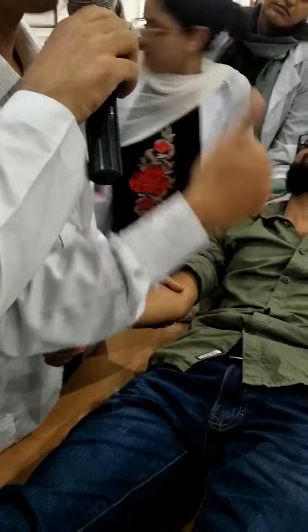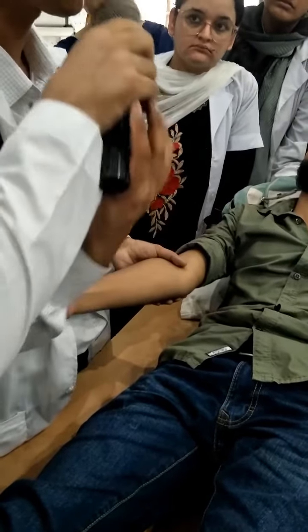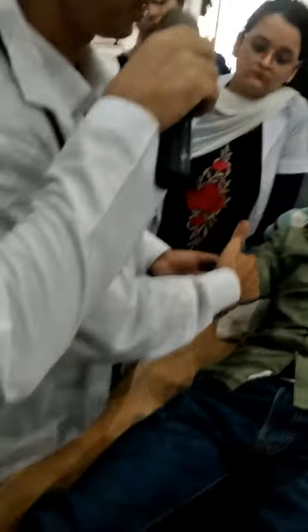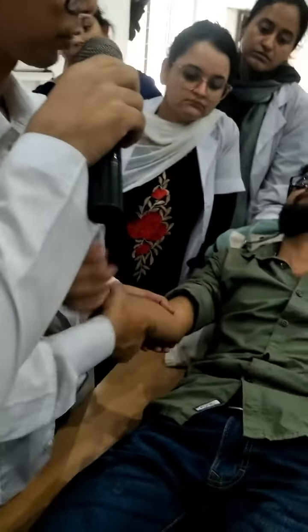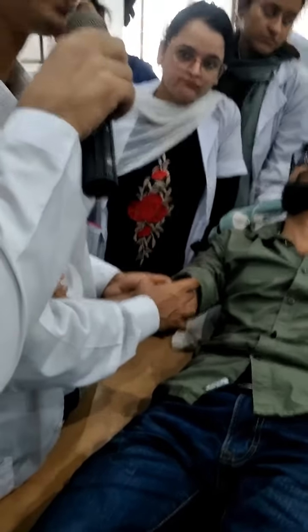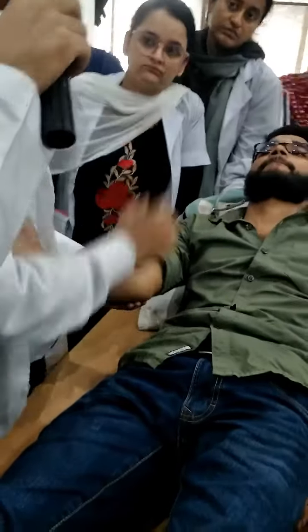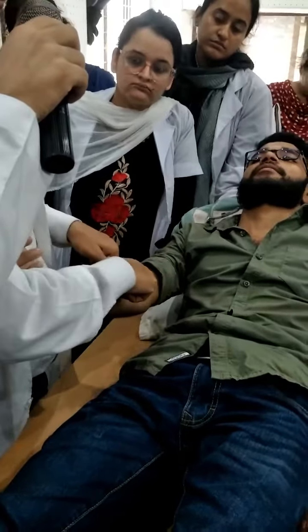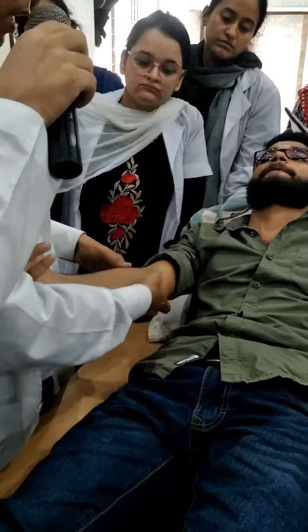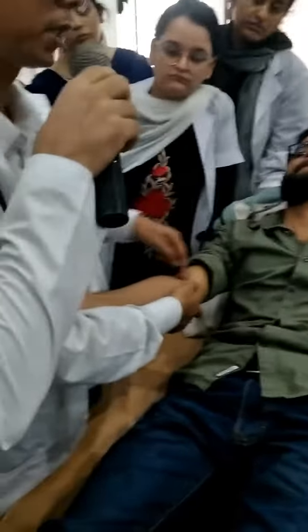How much? 2.5 cm. Place the cuff 2.5 cm above the elbow crease — that is the cubital position. If you place the stethoscope, then start with the pulse. The bicep tendon is the key landmark.